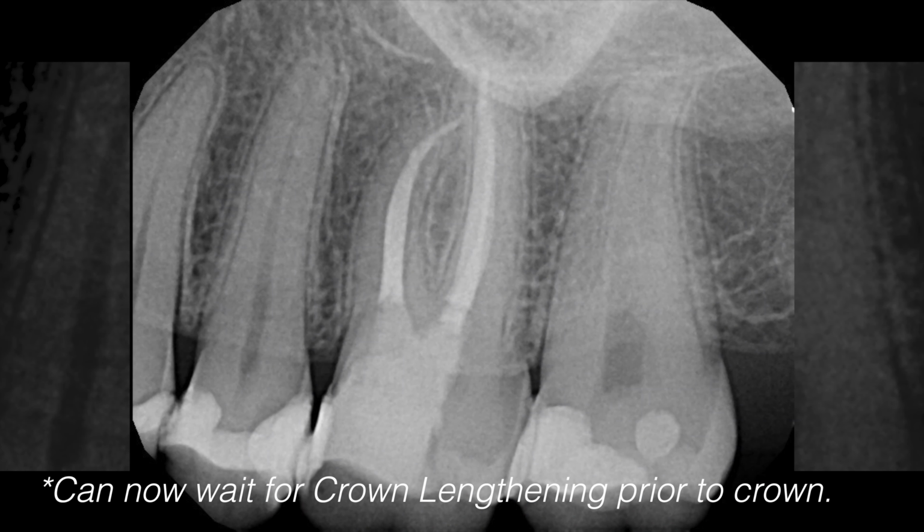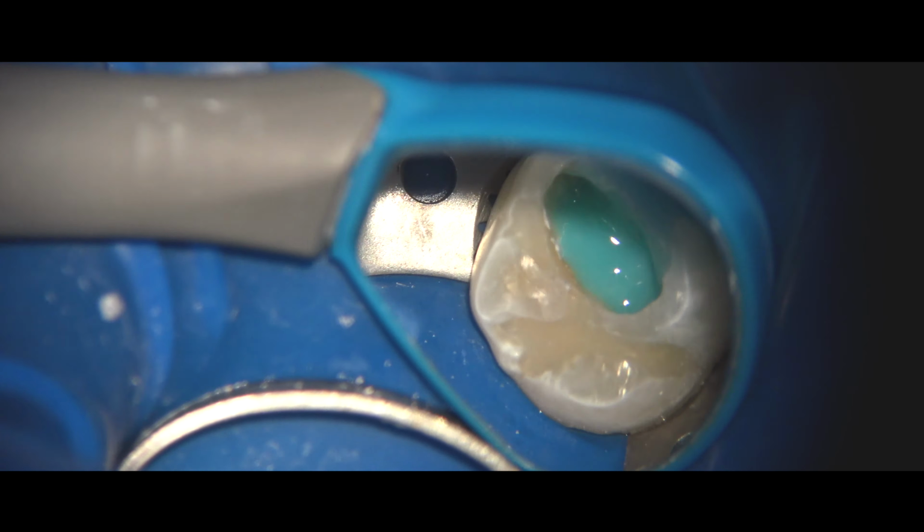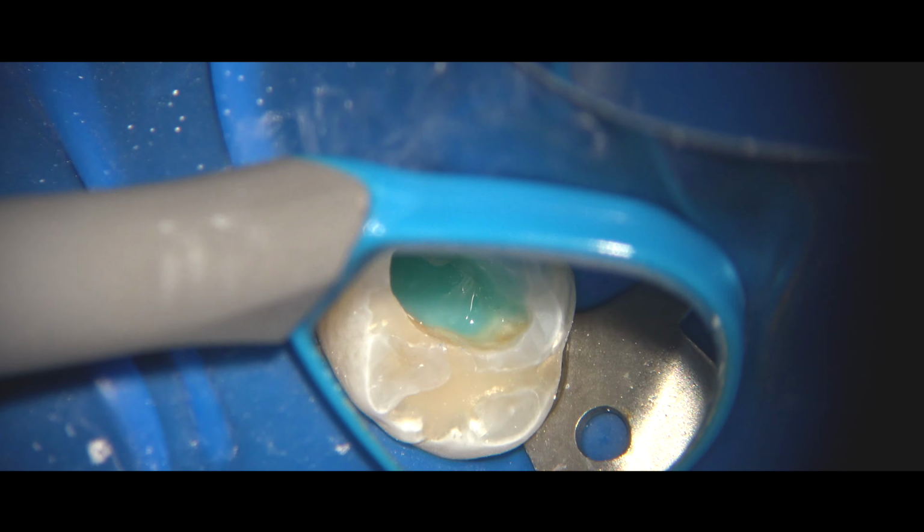So here you can fill up all the way from the floor to the top with a BC liner, and the advantage of this, compared to just placing a bonded type of composite in this case, is the fact that you have something that doesn't require etching and bonding, and that you are able to then remove easily, and has enough compressive strength as a base that you can then bond your final restoration to down the line whenever you want. And especially using the blue version, you'll have enough contrast so that you can just selectively remove the BC liner by 3 or 4 millimeters, and then have another 2-3 millimeters of the floor that would act as a base, and then you can place your core followed by the crown.